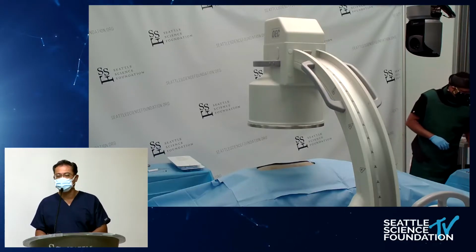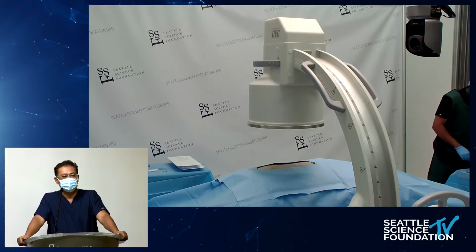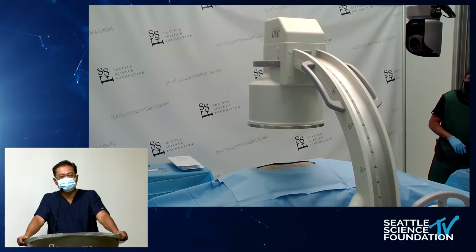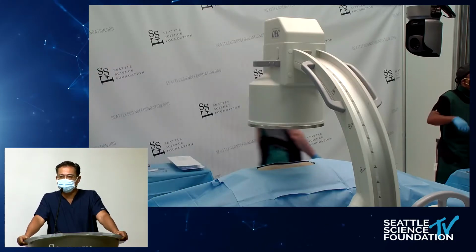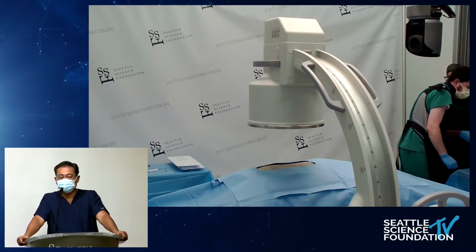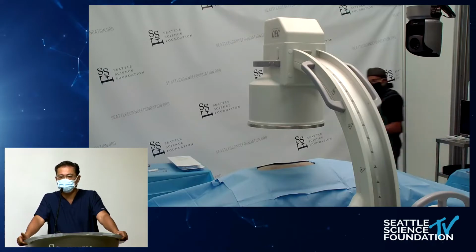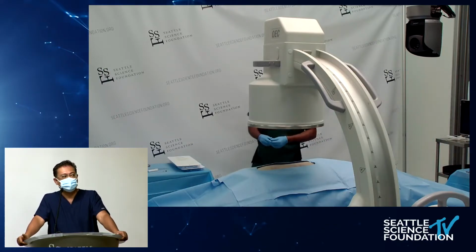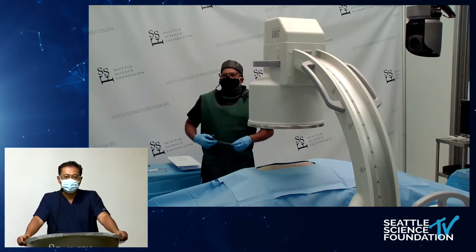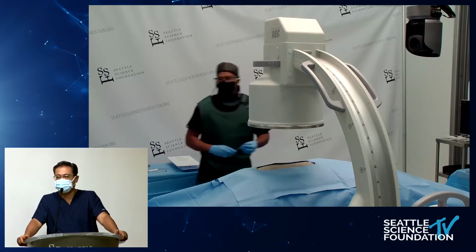Yes. I think it is quite important to help plan your approach, making sure that there are no anatomical abnormalities, any pathology in your way, or hardware in your way. A lot of times we'll see a lot of post-laminectomy syndrome patients in my practice, so we want to make sure we're not entering an interlaminar space where there's a laminectomy or laminotomy.